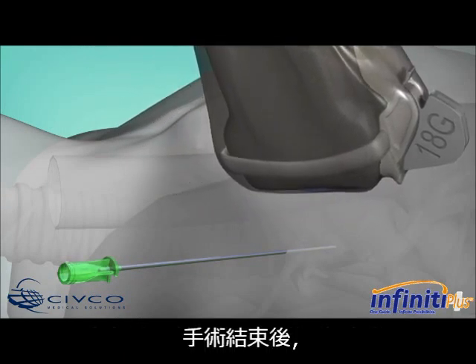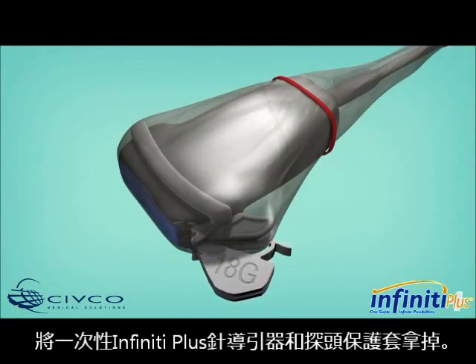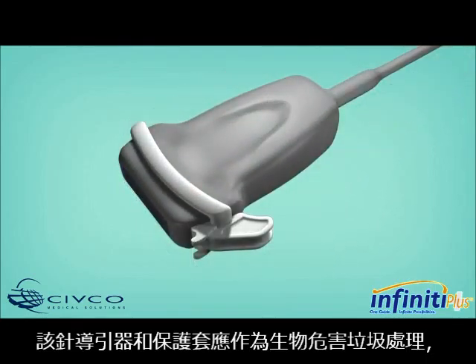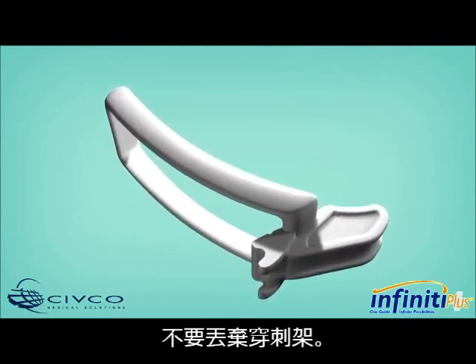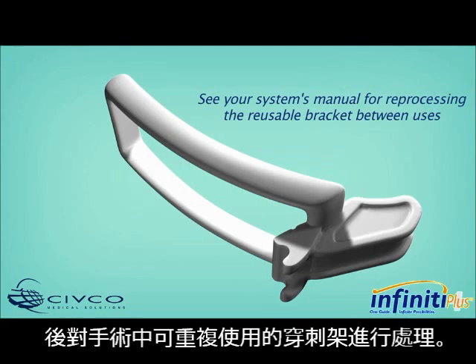The open channel design allows users an efficient needle release for viewing the anatomy in both the short and long axis. Once the procedure is over, remove the disposable Infinity Plus Needle Guide and transducer cover. The guide and cover should be disposed of as biohazard trash or as required by your facility. Clean the reusable bracket — do not discard it. See your system's manual for reprocessing the reusable bracket between procedures.